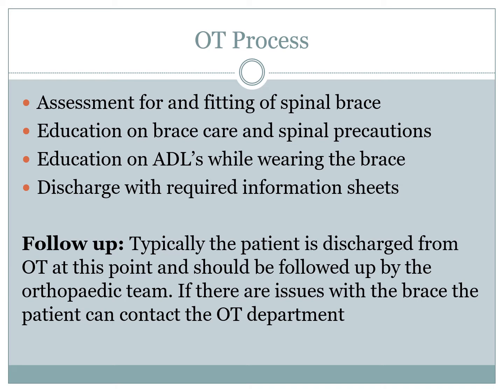This includes how to get in and out of the bed using the log roll technique, and also looking at dressing and if the patient requires any lower body dressing aids. Once everything is satisfactory, the patient is then discharged from OT with the required information sheets. Typically, the patient is discharged from OT at this point and should be followed up by the orthopedic team.